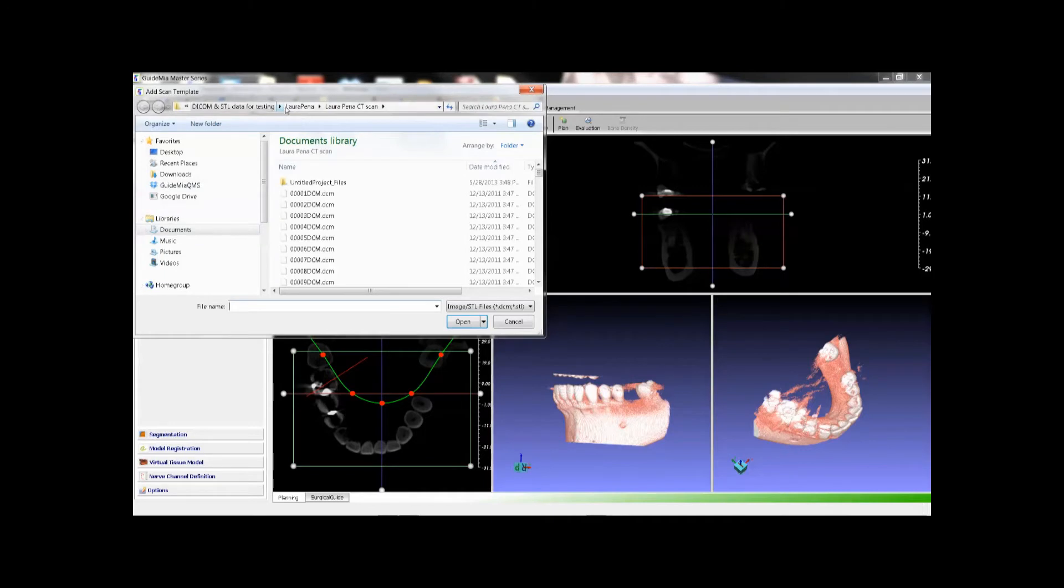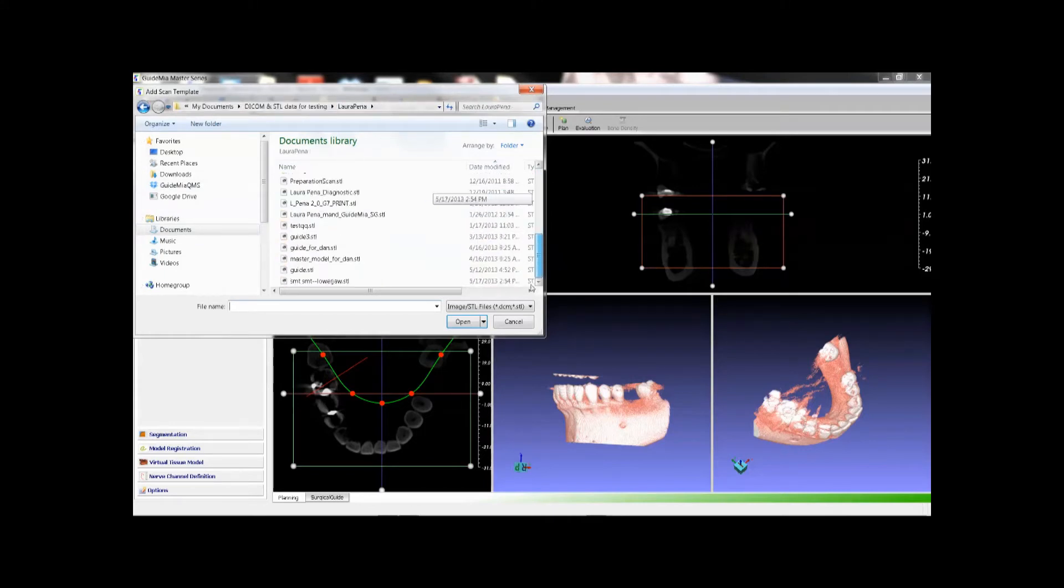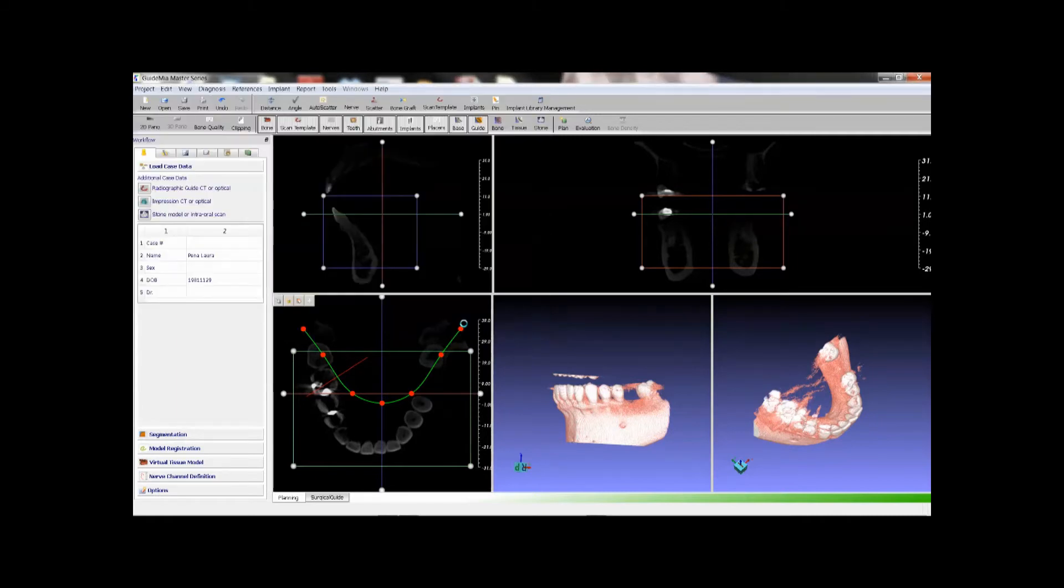Next we will load the optical scan of the stone model. Select the STL file. The model is loaded.